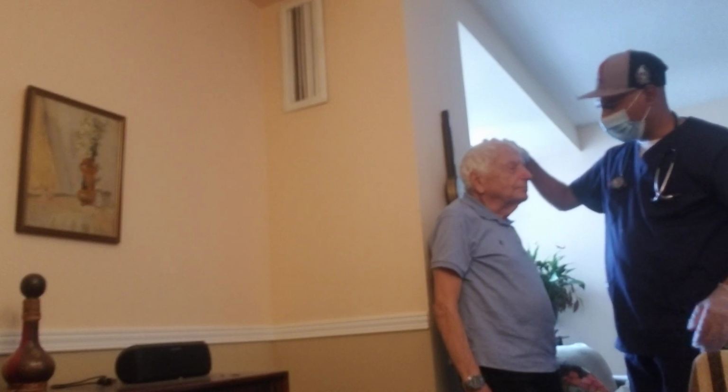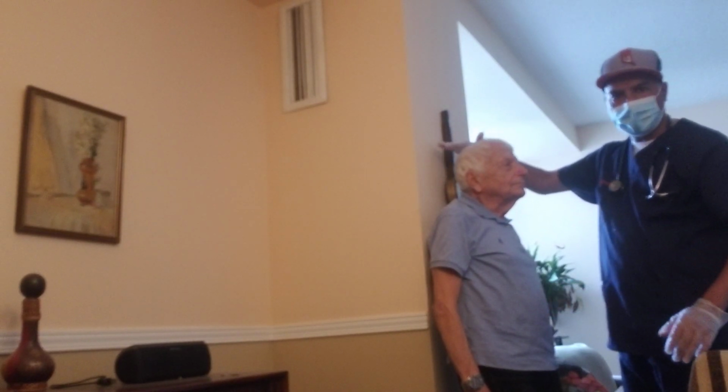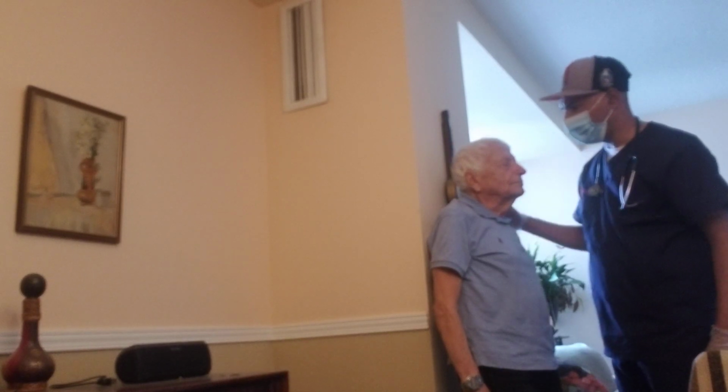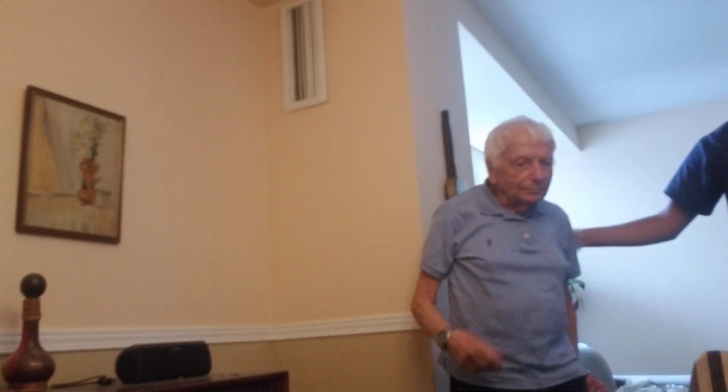So, okay, so straight with the wall. So I can see that Paul's height is approximately 170 centimeters. Okay, so Paul, you are 170 centimeters tall. Please come back and sit. All right.